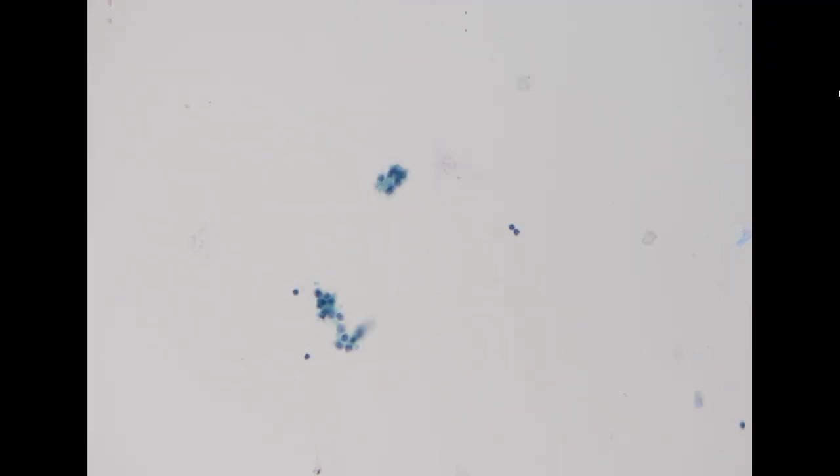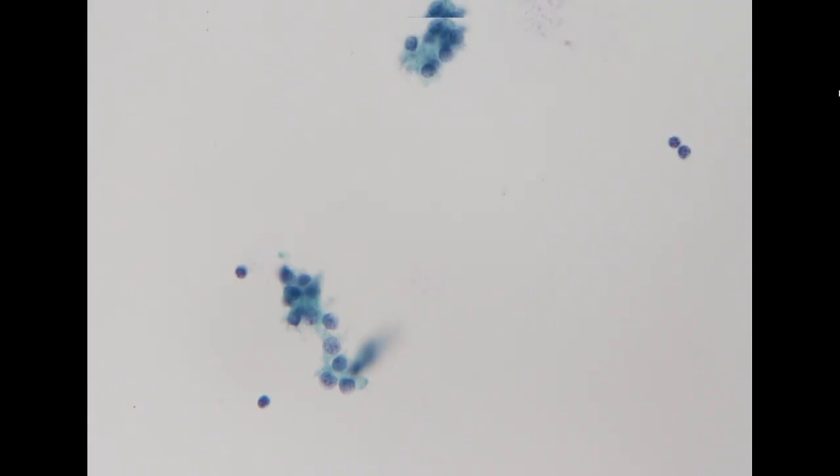In the new Bethesda system, they only recommend that we do subclassification for whether there is nuclear atypia or not. But here we still use the more detailed subclassification, just to help the clinician navigate the nature of these indeterminate nodules.